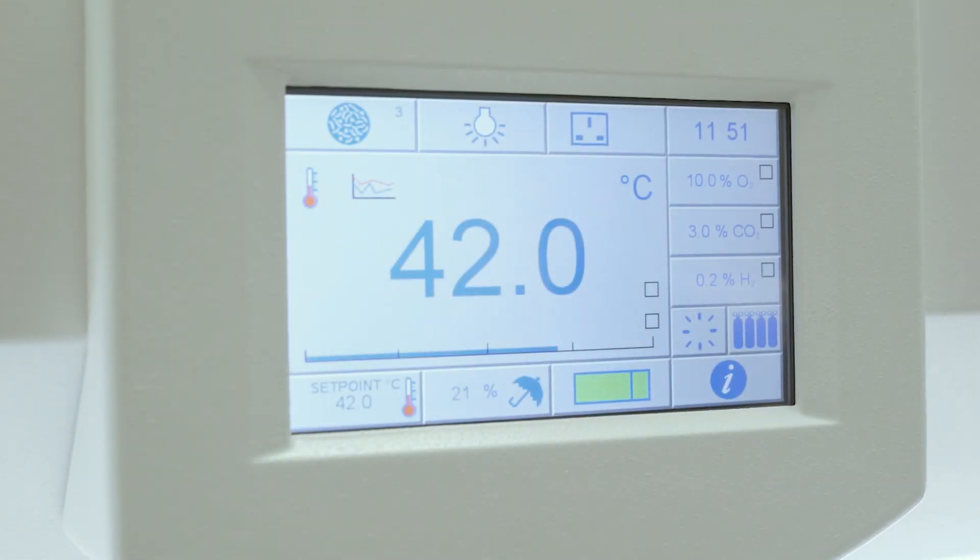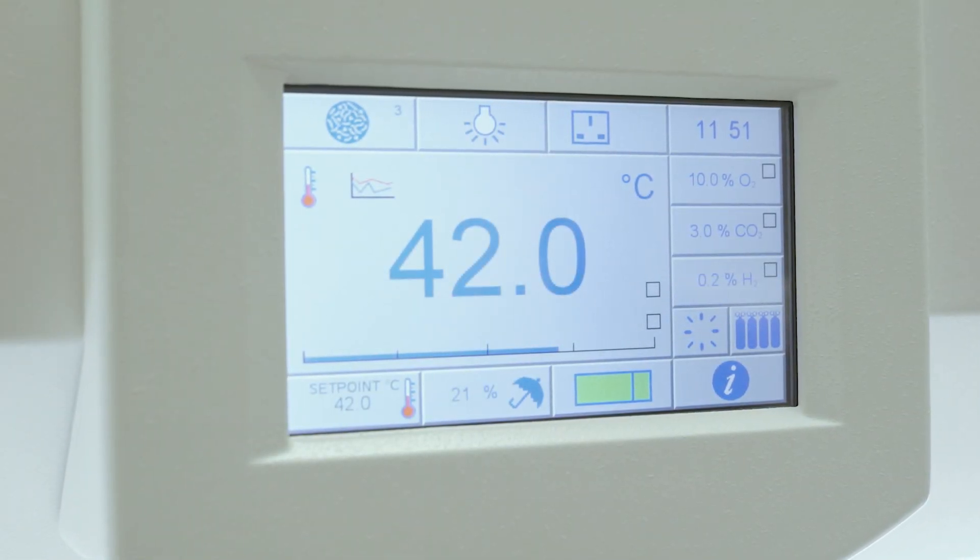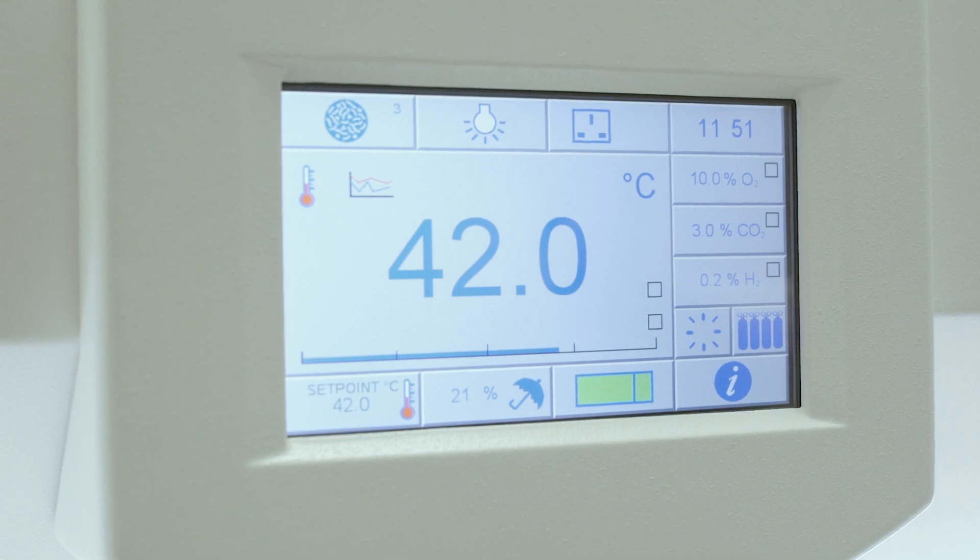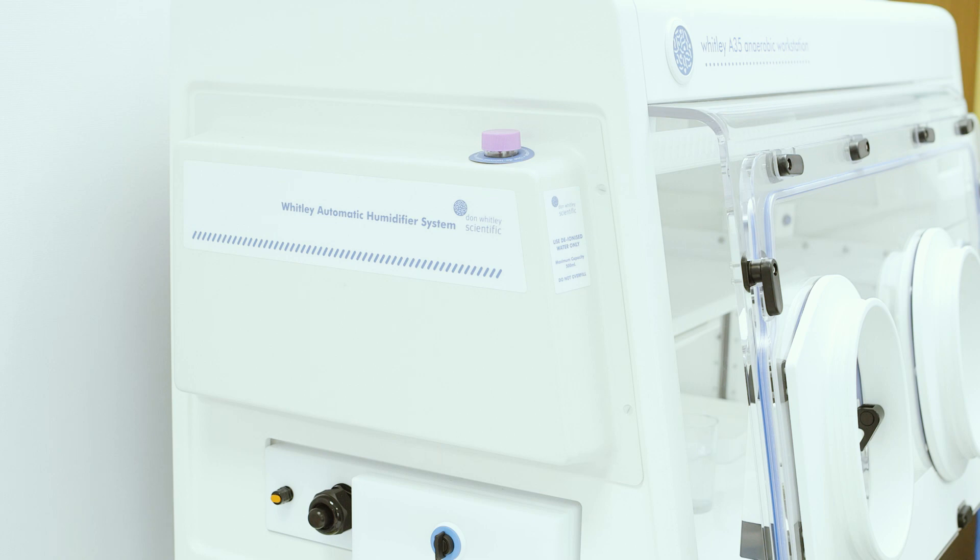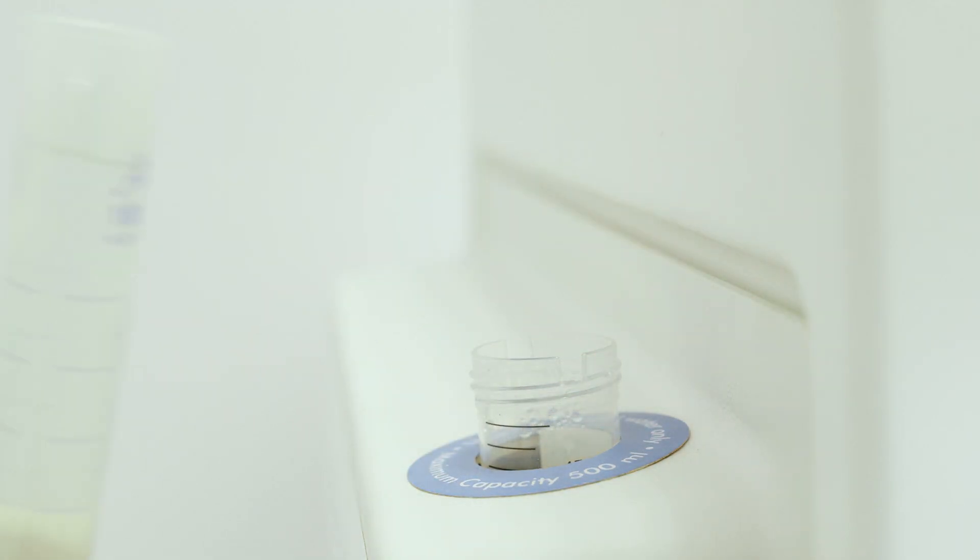Temperature can be precisely controlled in increments of 0.1 of a degree celsius up to 45 degrees celsius. These workstations maintain humidity at a level set by the user.